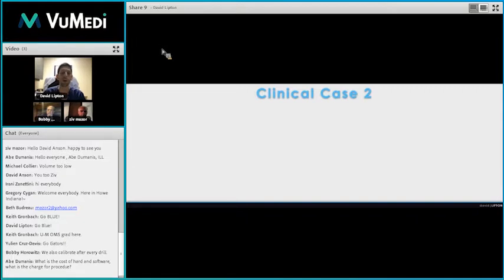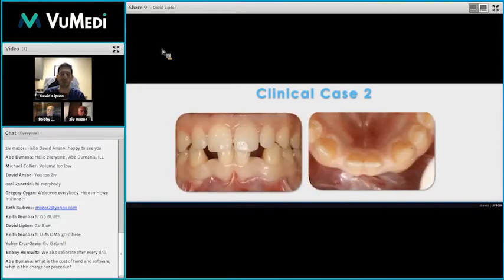So this is Ryan. Ryan is a 21-year-old college student who goes to school out of state, so it's a plane ride away. And at the time he was ready for implant placement, mom and dad did not want to pay for it or have him go through the surgery. And they didn't want bonded Maryland bridges in because if something popped out, he was 8-9 hours away, wasn't going to come back, so he had a transitional partial denture.